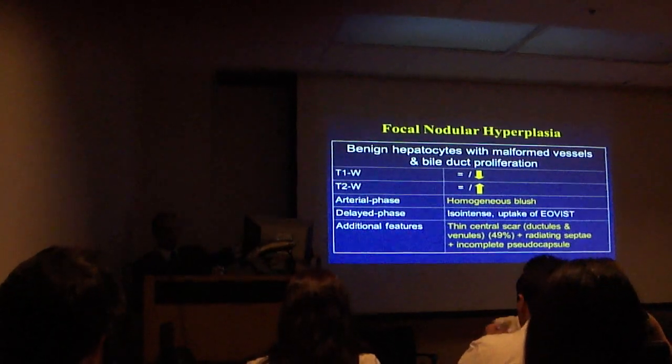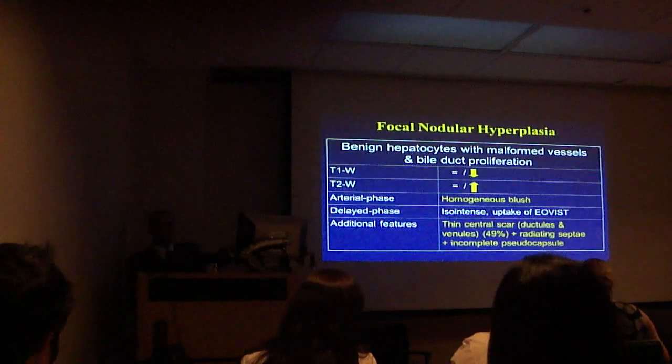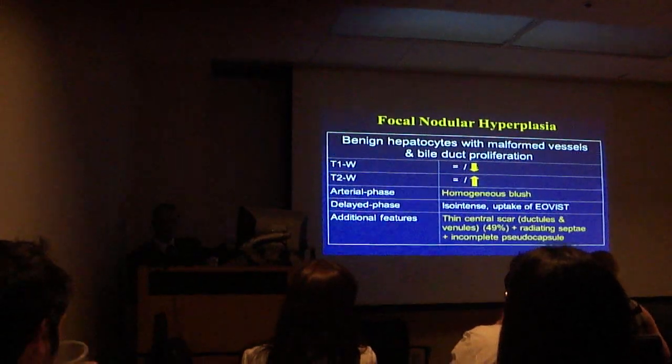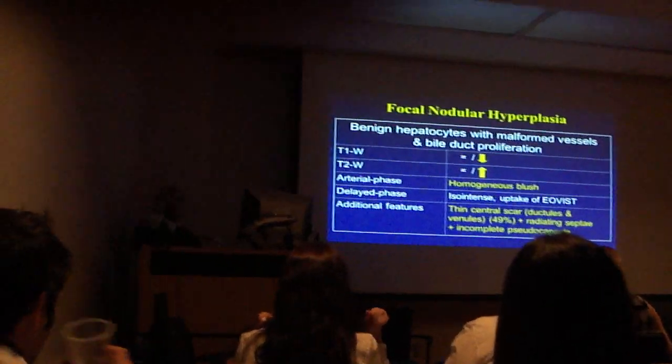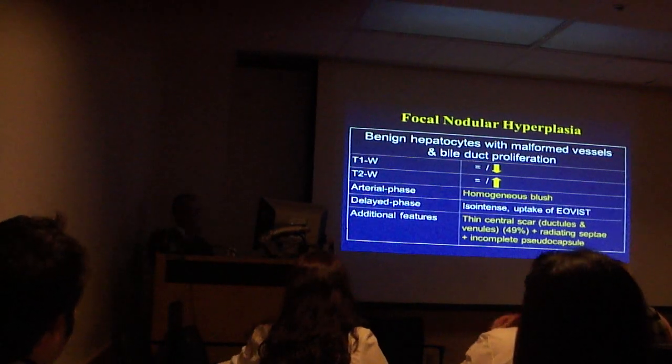So for the sake of academia, I'm displaying these here. You want to follow these, that's fine. You want to memorize those, that's fine. If they'll only confuse you, remember margin and washout. Those are the two things, and everything else will fall into place.